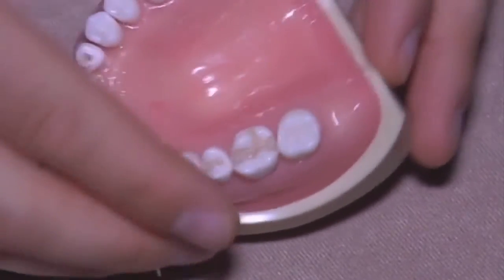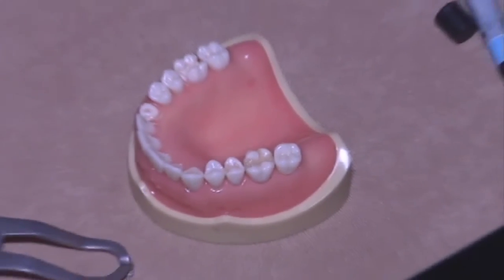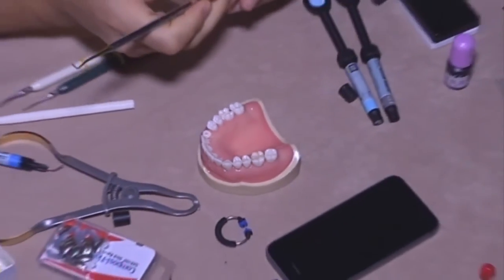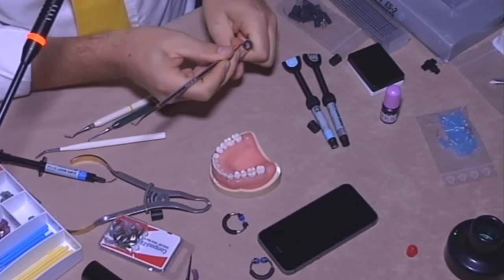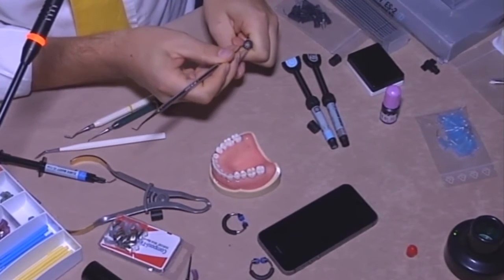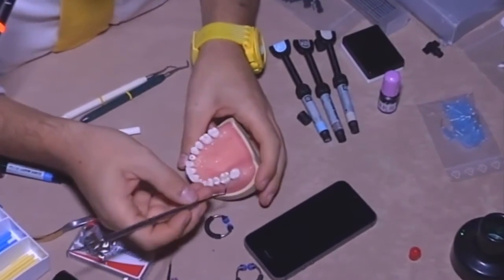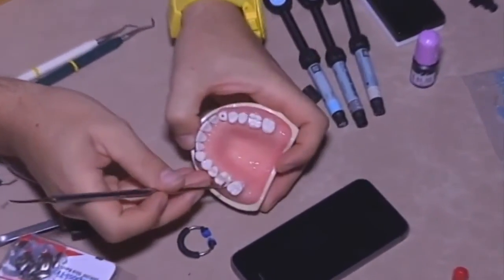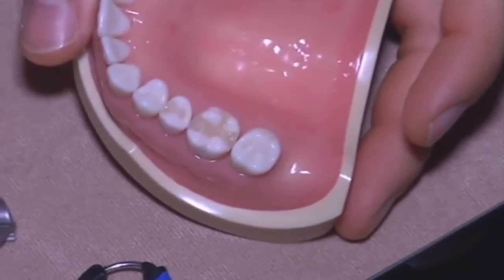And now we're gonna miss just the enamel. If you already shaped the dentin layer, the enamel is easier to place because you already have a project to follow.